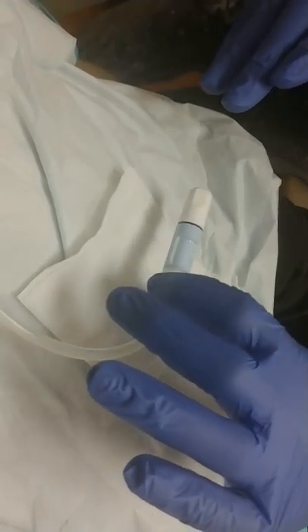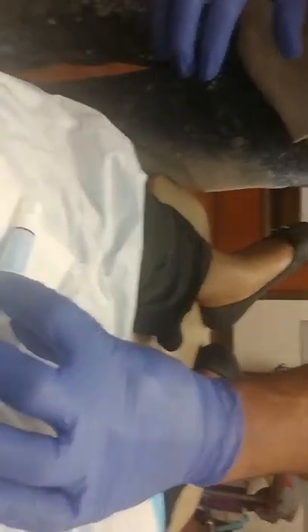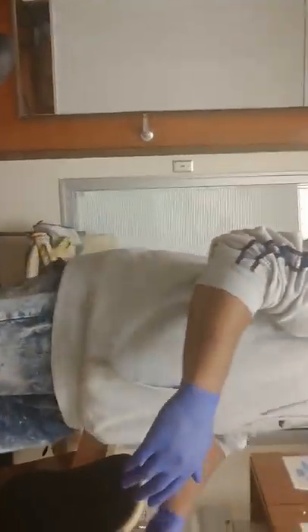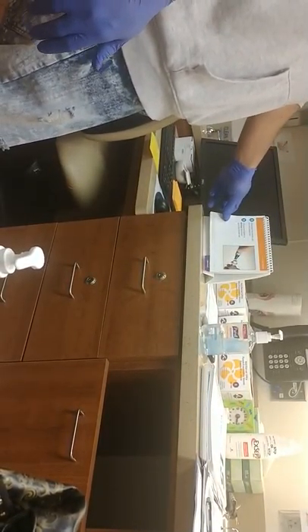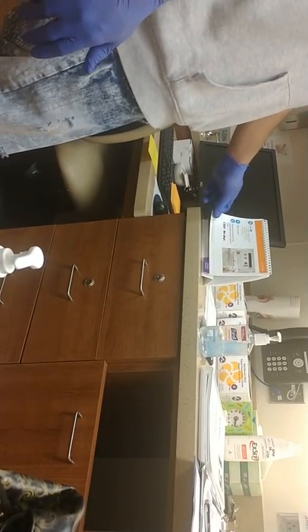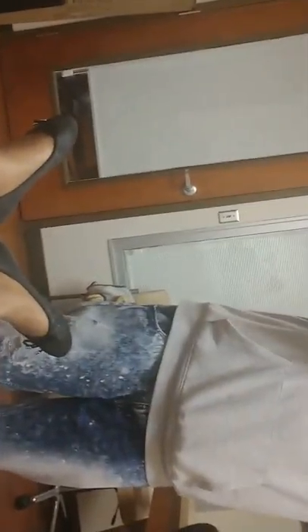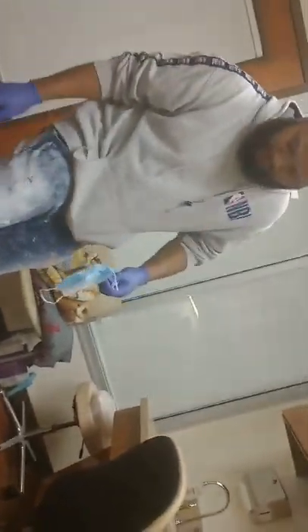Do you lock it back? I already did. Oh, okay. I did that before I even started. Okay. I already locked the transfer set. Okay. Right. And let's go over here. Did that. Did that. You can take your mask off now because this is capped. Once this is capped, you can take your mask off.